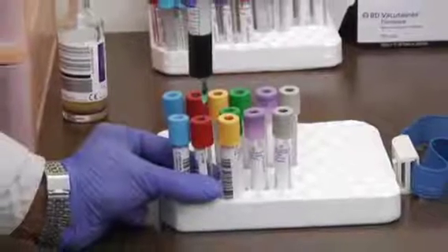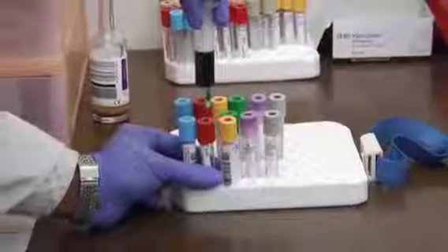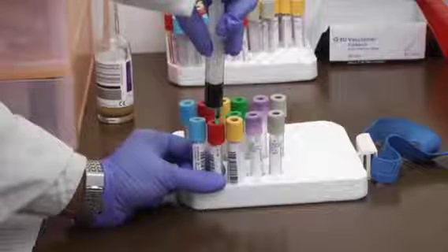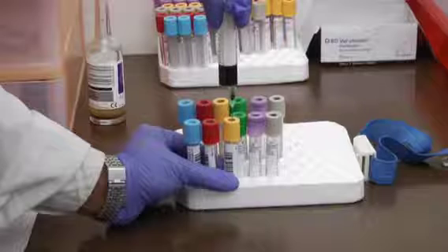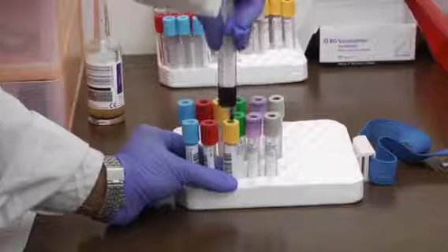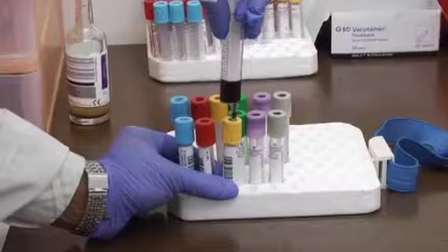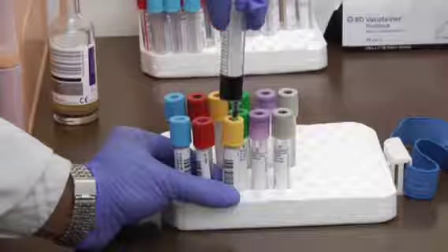To prevent needle stick injuries, use the one-hand technique to puncture the tubes with the needle to fill the tube under vacuum. Pierce the stopper on the tube with the needle directly above the tube using slow, steady pressure. Do not press the syringe plunger because additional pressure increases the risk of hemolysis.